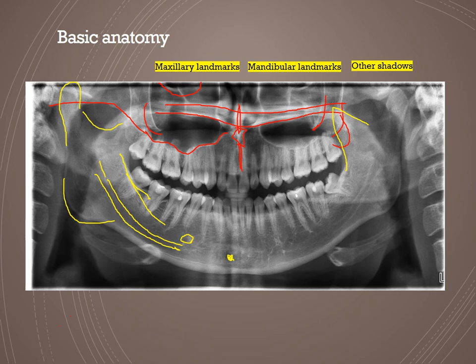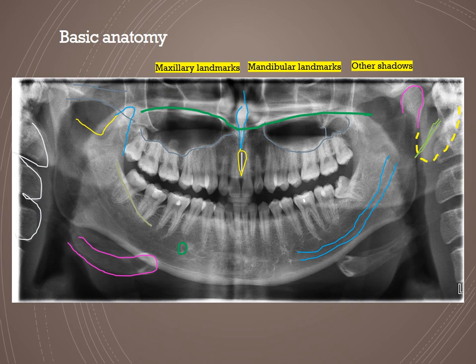Other shadows visible on a panoramic image include the shadow of the ear, cervical spine vertebrae, hyoid bone, and the styloid process. Both maxillary and mandibular landmarks are present in any panoramic radiograph, and it is important to keep looking at panoramic radiographs to recognize all of these anatomical landmarks and delineate the difference between an anatomical landmark and a pathology or finding.